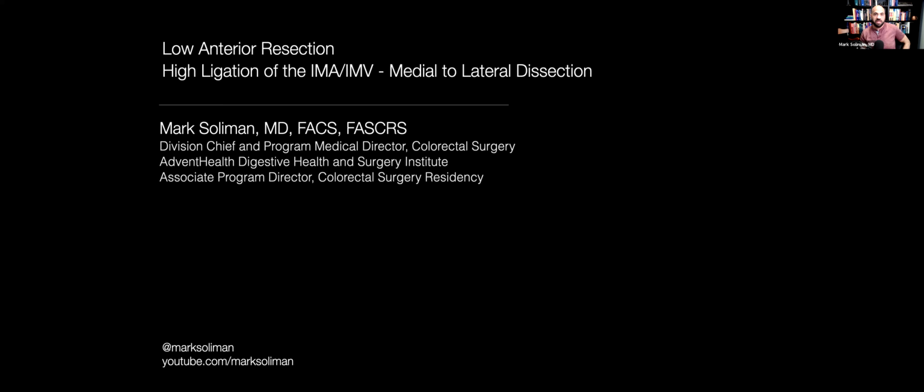As many of you know, this is the second in a larger series with the APDCRS. What we're trying to do is augment, not replace, the learnings that are happening at your local campuses when it comes to robotic colon and rectal surgery. The first discussion was by Dr. Ima, on the approach, which was the setup for a robotic case in general, the port configuration, and most importantly, the port placement philosophy.